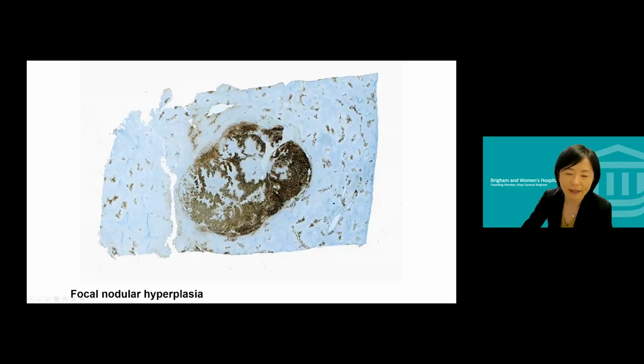a diagnosis. But I think one thing we need to know is that as FNH grows in size, it becomes easier and easier to diagnose by radiology. So for FNH bigger than 2 centimeters, it should be relatively easy to recognize by radiographic studies. When they biopsy a liver lesion, they tend to be small, 1 centimeter or 1.5 centimeter. For these lesions, the chance of the needle only hitting the area with diffuse positive staining is less, not as much compared to much bigger lesions.